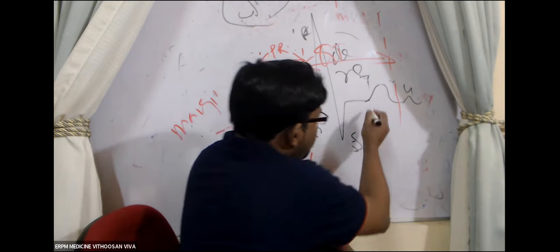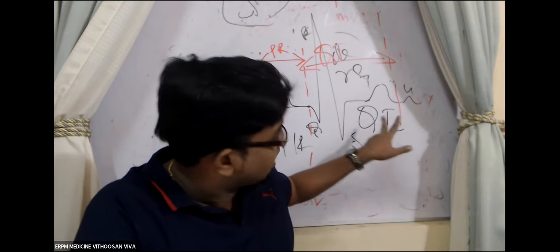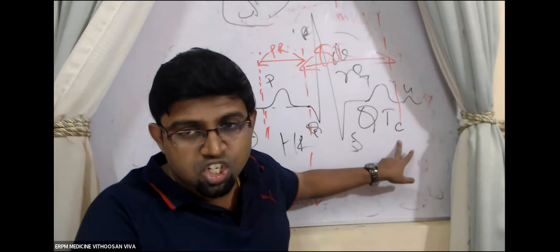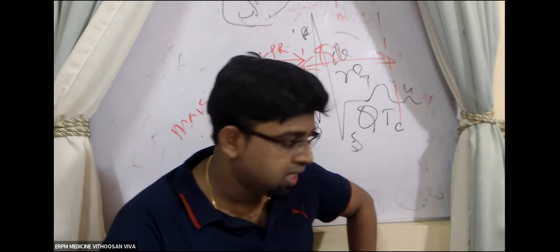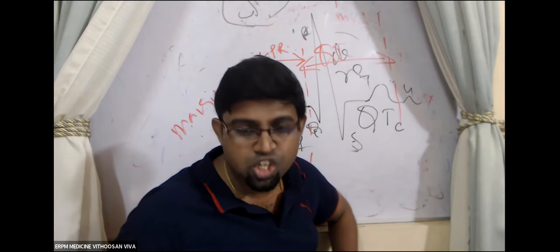That's why we are using a term called QTc. C stands for corrected.